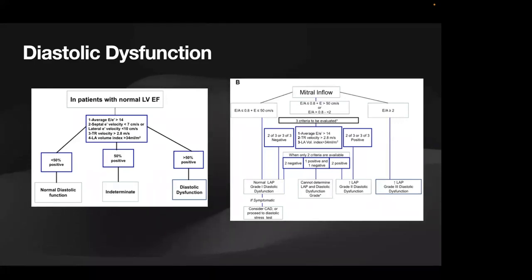I think back always to when I first started learning about diastolic dysfunction, and I was rounding in the ICU way back when, and my fellow said, well, does this patient have diastolic dysfunction? And I said, I don't know. And he says, well, you do know. If they have systolic dysfunction, they by definition have diastolic dysfunction. But I've expanded my knowledge to understand that systolic dysfunction is not the only reason you can have diastolic dysfunction. And I agree with you that these markers are there in a vacuum, based on just looking at no valve issues, just looking at myocardial performance, et cetera.